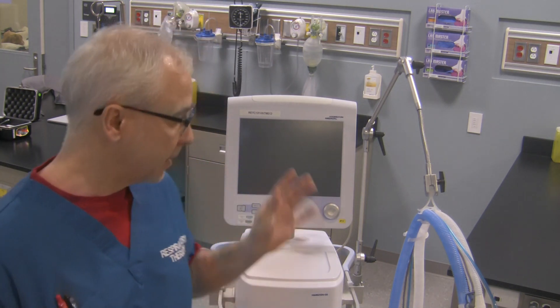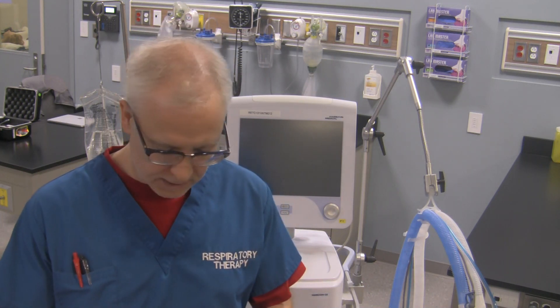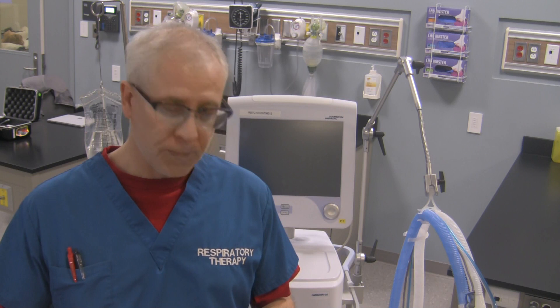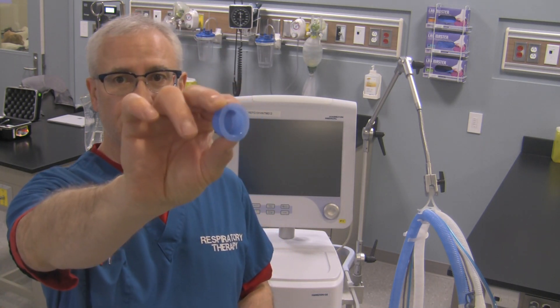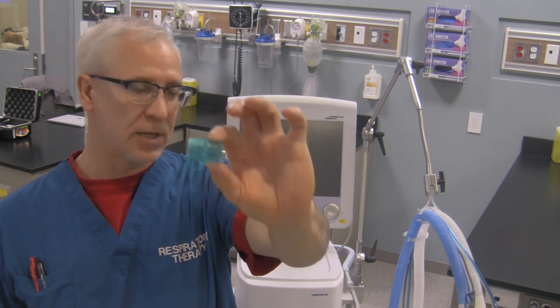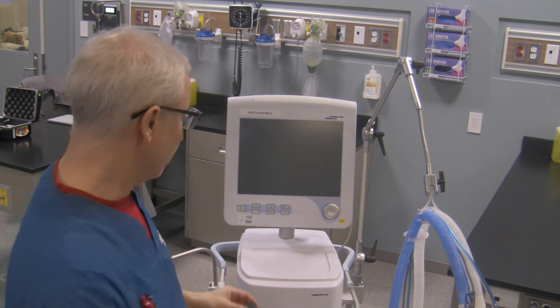Now, in order to do this ventilator check properly, you'll need the ventilator properly circuited. Make sure all the connections on the ventilator are nice and tight because you'll have to do a tightness check afterwards to check the integrity of the external circuit. You'll also need a plug like this for capping off the circuit, and the adapter for the flow sensor connection at the end of the patient Y. You need these two things for doing the test.